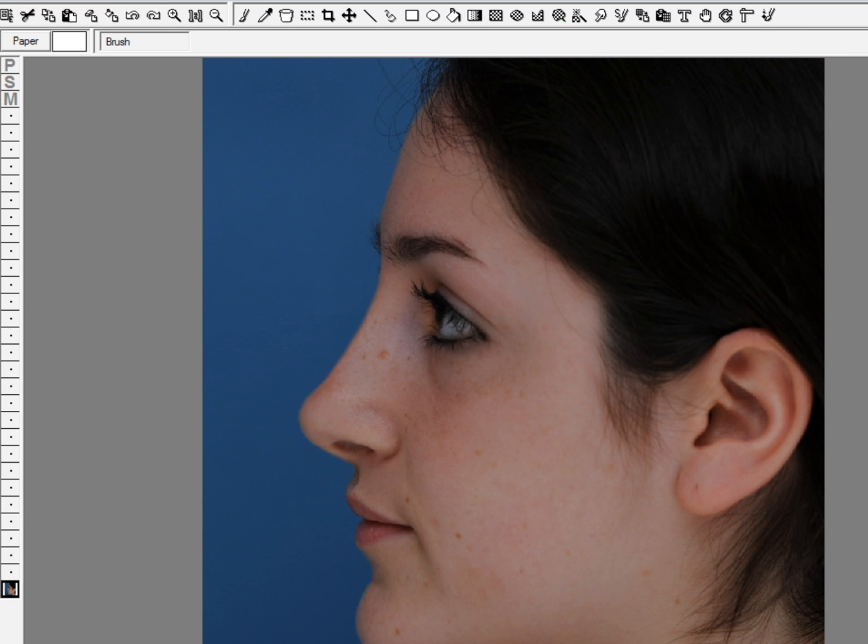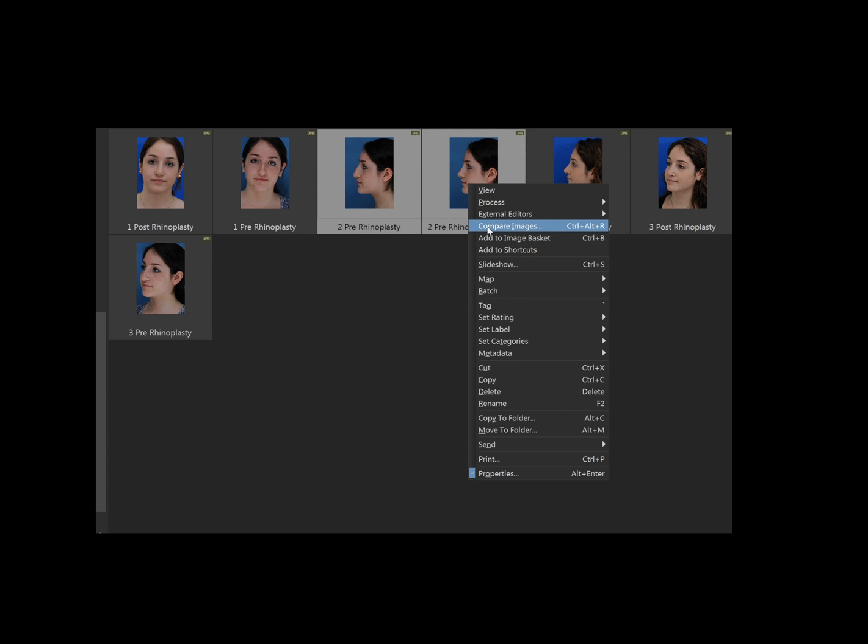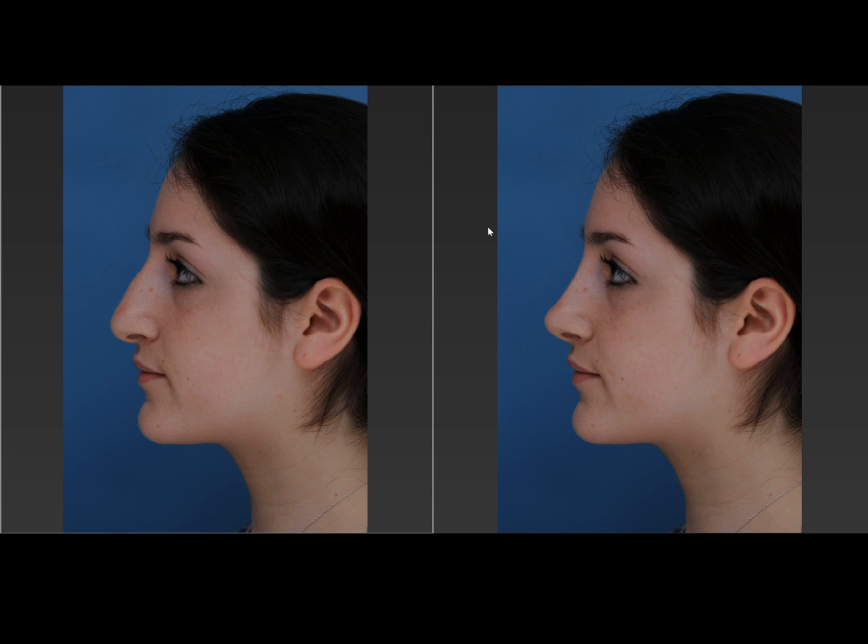Once we have an image that the patient likes, we'll save it. So here we are with our pre-imaged look and our imaged look. We can show those side by side and say, well you know, does that look good to you or do you want to see a little bit more, and we can continue to play with the images appropriately.